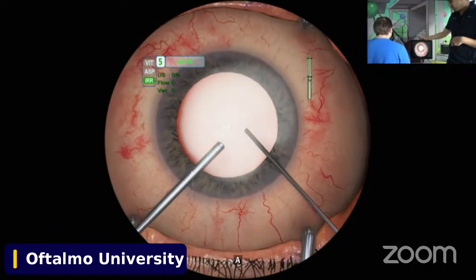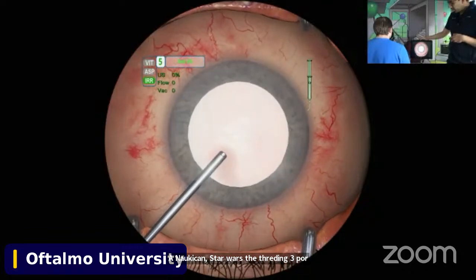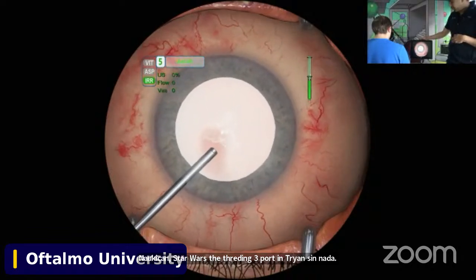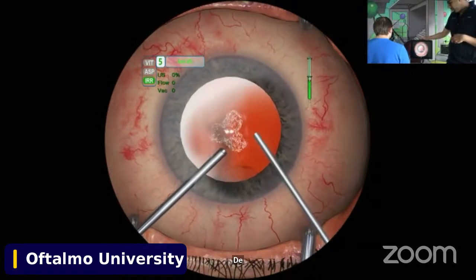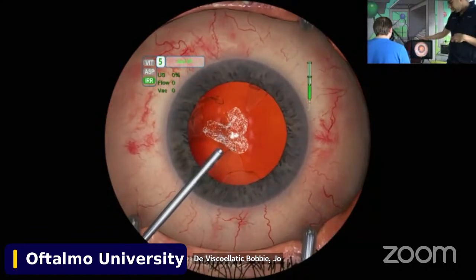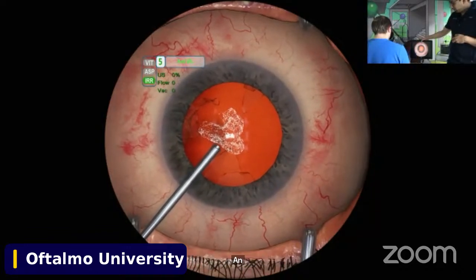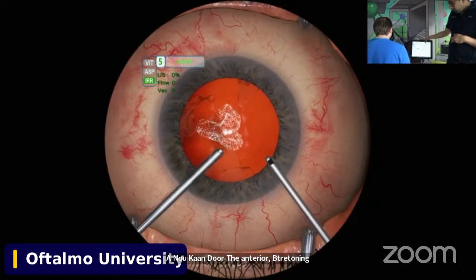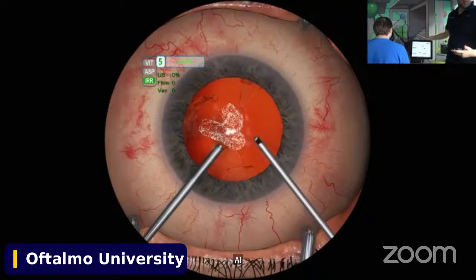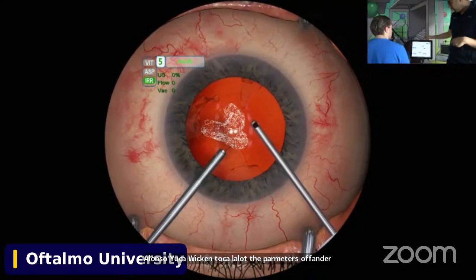First, put in triamcinolone. Then viscoelastic, OVD. And now he can do the anterior vitrectomy. And also, we can talk a lot about the parameters of anterior vitrectomy, when to do first cut, then aspiration, when to do first aspiration, then cut.